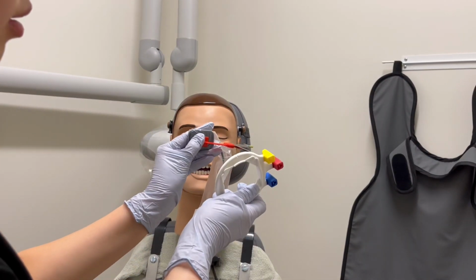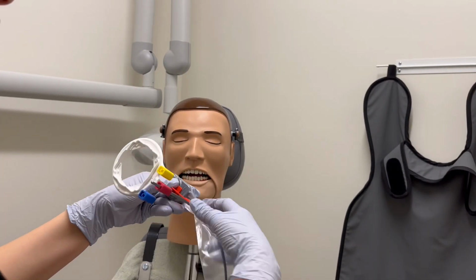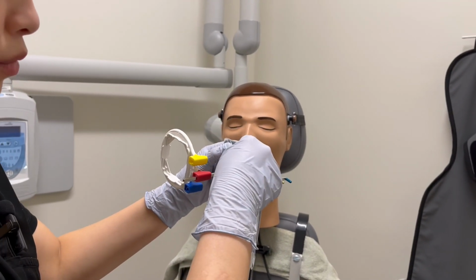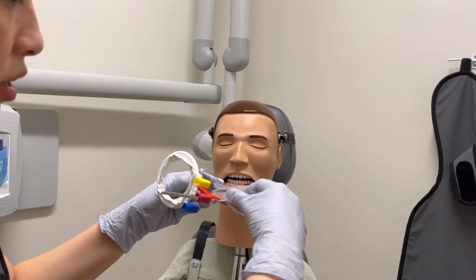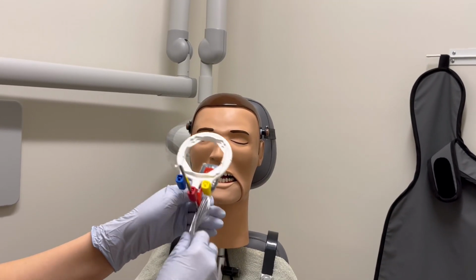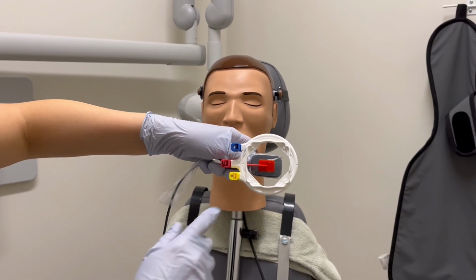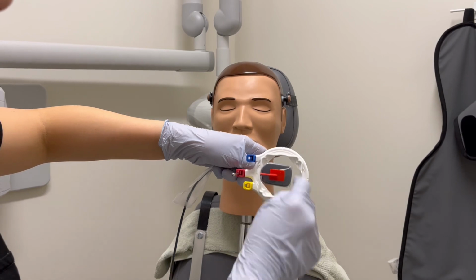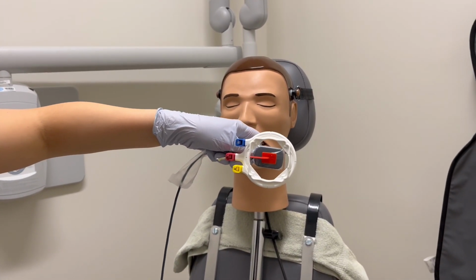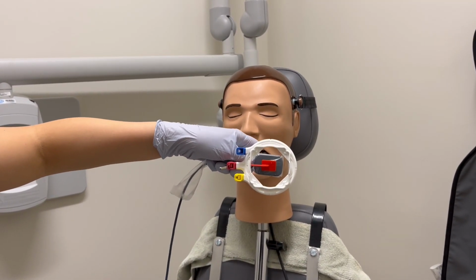Last step. Red with the red prongs with the red bite block. So everything is color coordinated. This is our final check. Is the sensor smack down in the center of the plastic ring? If the answer is yes, then that is the correct assembly of the RINN.